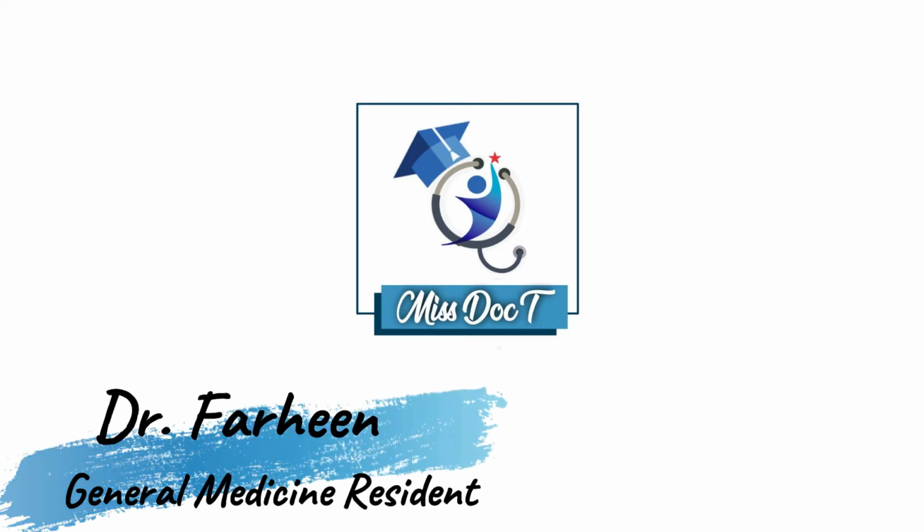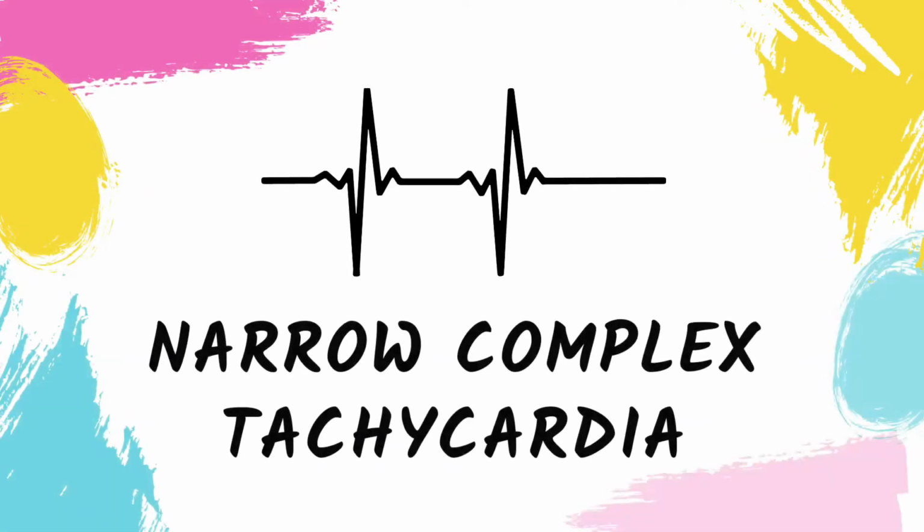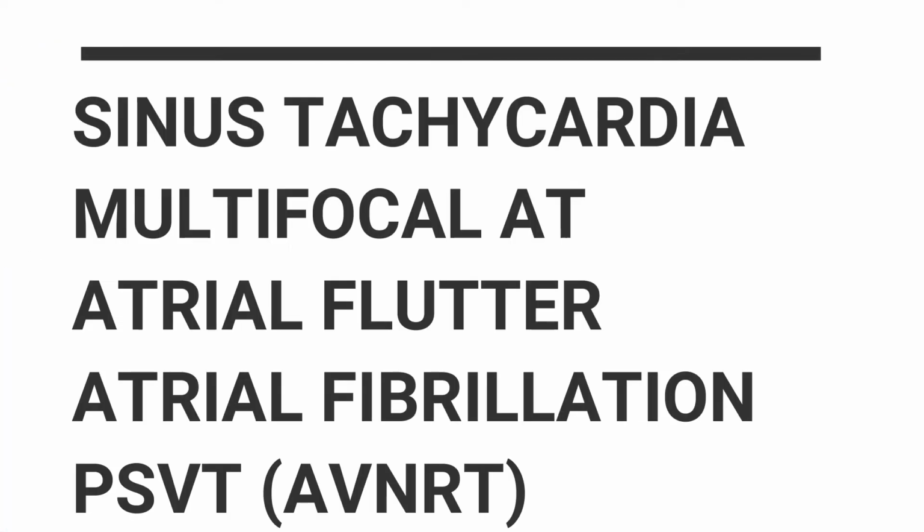This is Dr. Farheen, General Medicine resident, and today let's discuss narrow complex tachycardias. In this video, you will learn the ECG interpretation of sinus tachycardia, multifocal atrial tachycardia, atrial flutter, atrial fibrillation, and paroxysmal supraventricular tachycardia. So let's get started.